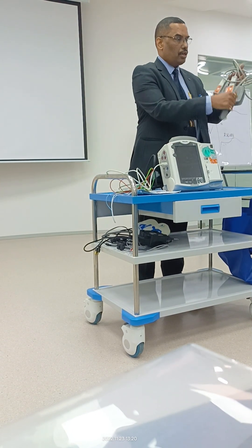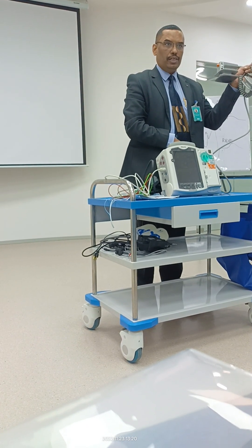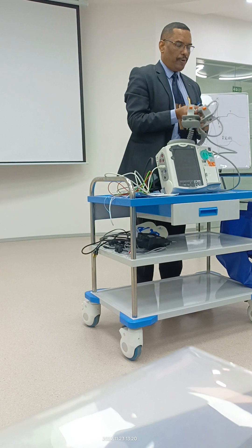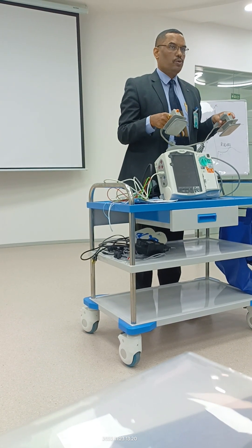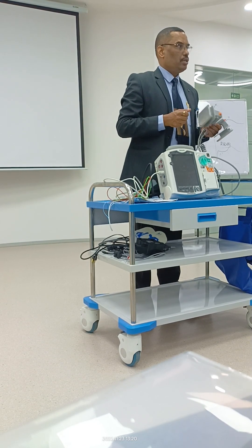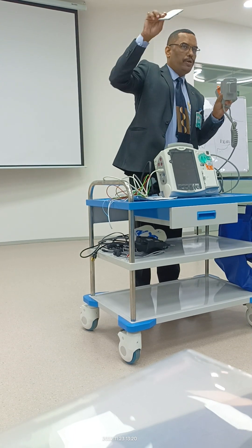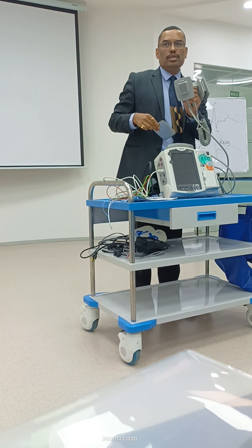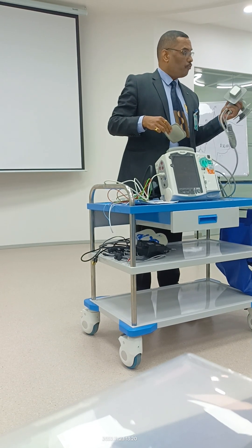We have these face paddles — these are called defib paddles. The same paddles can be used for pediatric patients as well. Whenever you see there's a small knob here, you can slide and press it to get a smaller panel, which is used for infants and pediatrics.